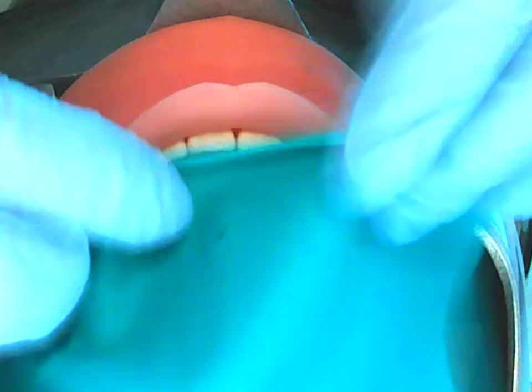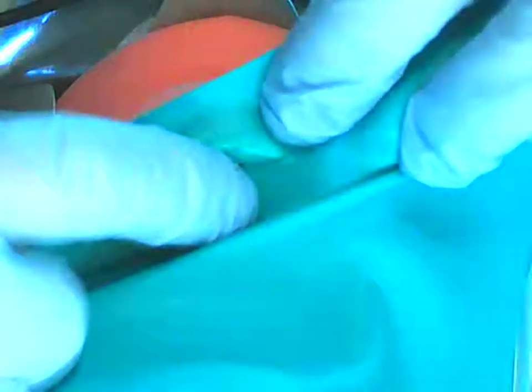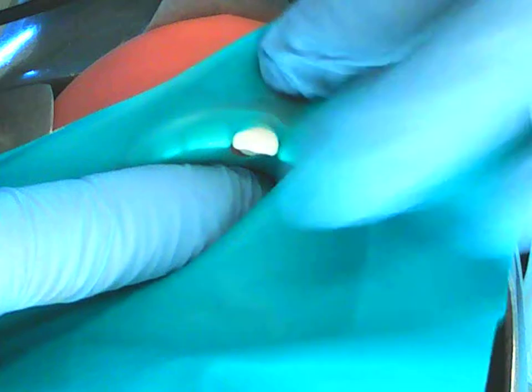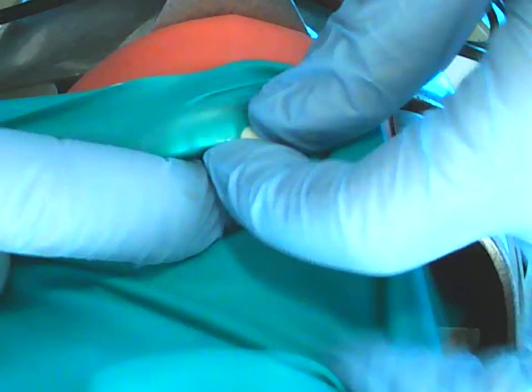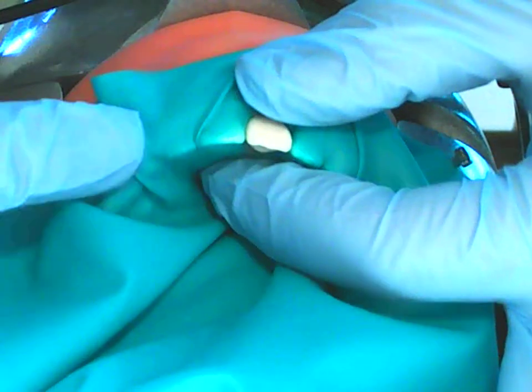Okay. As previously mentioned, I punched the single hole for the tooth size. So even though the clamp is going on this tooth, because we're placing the dental dam first, it only needs to be a size 2 hole to go on the 2-1. Okay, so dental dam is placed first in this situation and placed over top of your tooth, like so. Okay. What you want to ensure is that you're retracting the dental dam on both facial and lingual aspect as much as possible.